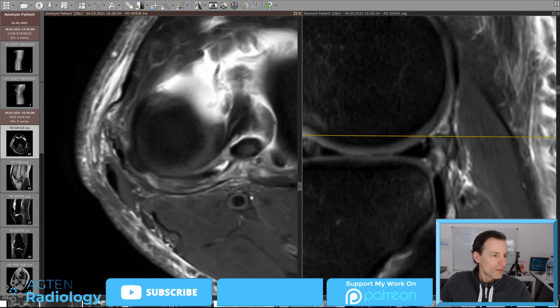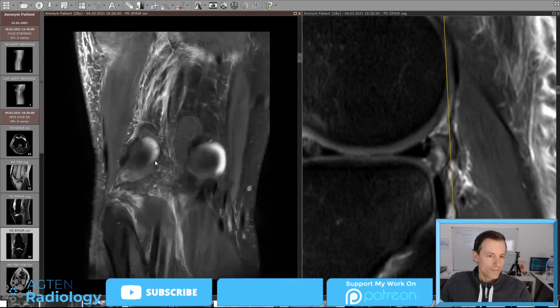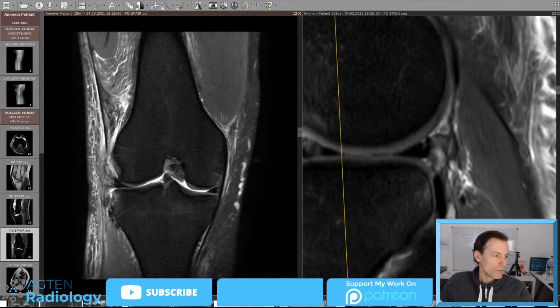And if we are now having a look at the ALL, so let me just pull up this illustration from my last video.